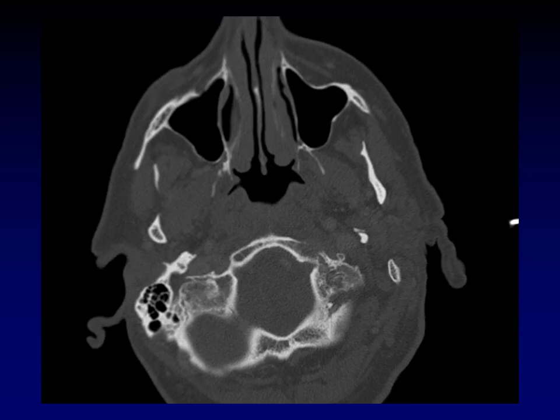Here's a bone window right next to the hypoglossal canal. There it is — there is the destructive mass that is eroding into the hypoglossal canal and injuring the hypoglossal nerve, causing that denervation atrophy. Look at the normal cortex on the other side that's been disrupted on this side. Look at the disruption of the medullary cavity. This is a metastasis from colon cancer that has hit the skull base and injured the 12th cranial nerve. Thank you very much.